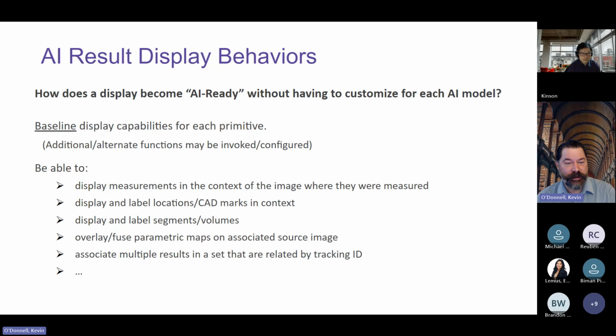The downstream machine consumers of this data are just as important as the downstream human consumers. And frankly, the humans can look at a screenshot and get the rough idea, but then they want their tooling to do something smart with it, like copy this measurement into my report. And if all you've got is a screenshot, the application says, what measurement? I see a bunch of pixels. You want me to do screen scraping and OCR or something? And so we totally bypass the screenshot. You can certainly do that, but that's sort of the very poor man's approach to this.